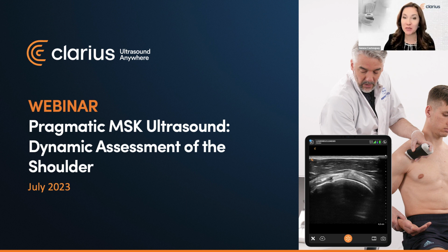It's been wonderful to partner with Sonoskills to bring you today's educational event. In a moment, we'll be joined by renowned educator, Mr. Mark Schmitz, who will be teaching us anatomy, sonoanatomy, technical scanning skills, and pathologies common to the shoulder. You'll learn MSK ultrasound scanning skills that you can use on your next patient to make a confident diagnosis and expedite the right treatment plan for a more rapid recovery. A quick housekeeping note, please do use the Q&A icon at any time during today's session to ask questions, which we'll address in a live session following the presentation at the top of the hour.